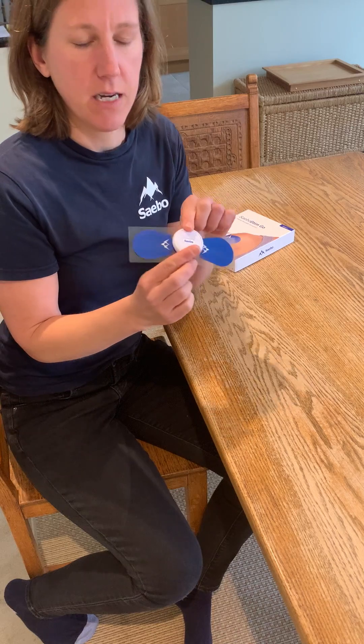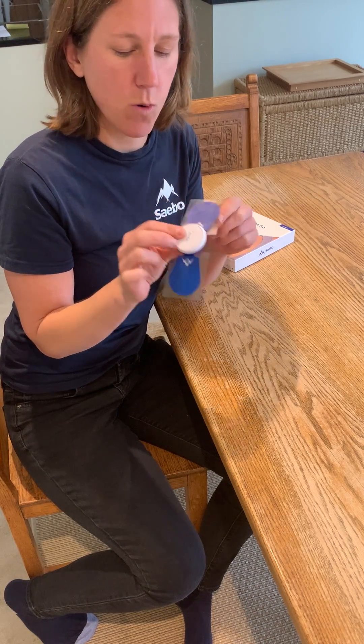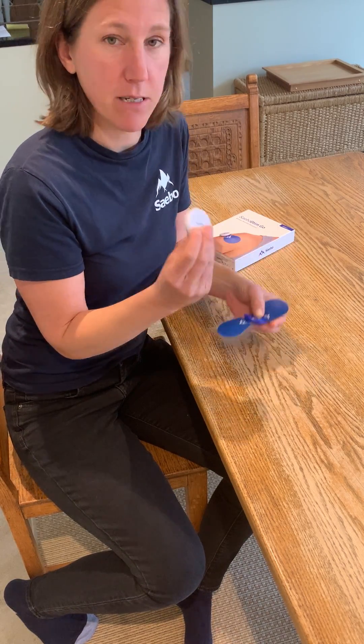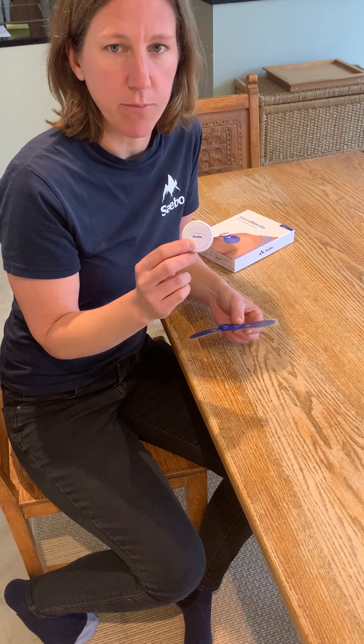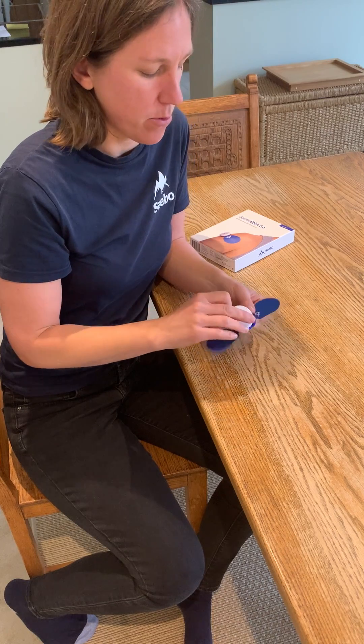This is the device. As you can see, there are no wires. The white disc is the power disc, and to charge it you just use the cable supply that connects into a USB port. There's just one preset program.